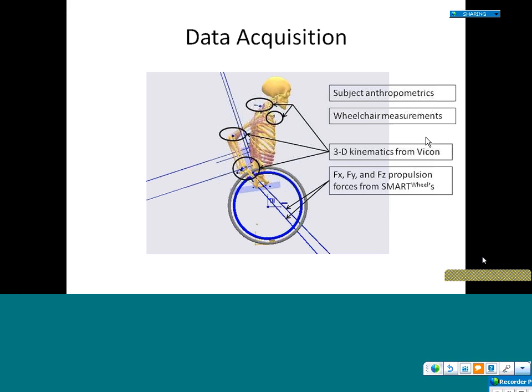And lastly, I'm going to be collecting some surface EMG from 12 muscles. I'll talk more about what particular muscles later, but I want to mention that this is critical for use in validating the model. Unlike the first two things I talked about, the anthropometrics and the measurements, I'm not using this EMG to help build the model, and I'm also not using it to help drive the model, like the kinematics and the kinetics, but I'm using it to aid in validating the model.